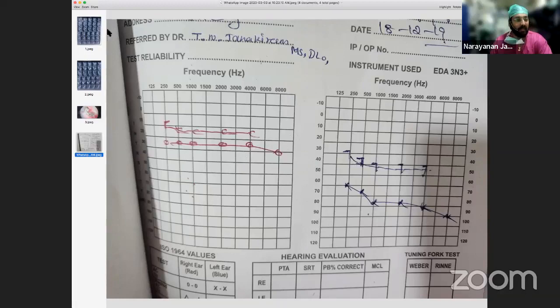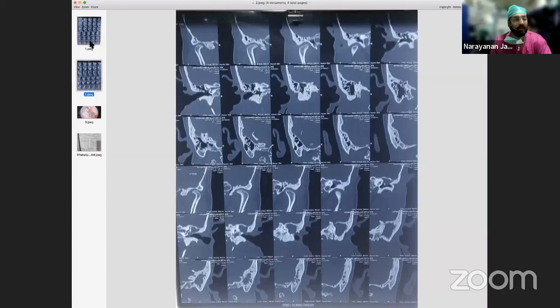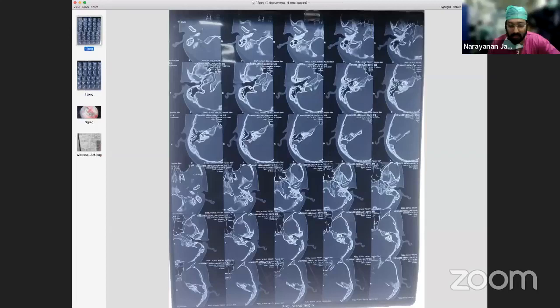Now you can see here that this is the scan. Let us read it from above downwards. Okay, now from above downwards, you can see the superior semicircular canal, the signet ring appearance. You can see here that's the internal acoustic meatus, facial nerve, cochlea is here. The malleus is eroded, ossicles are all eroded, and you can see the sinus tympani filled with some granulations or some soft tissue. The stapes may be intact, but it's so small I'm not able to see, but definitely the malleus, the incus is necrosed, body of incus is necrosed.